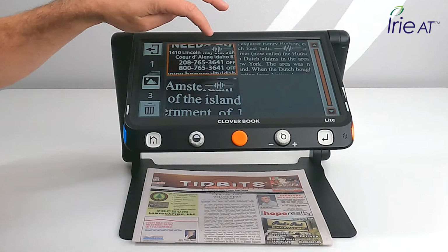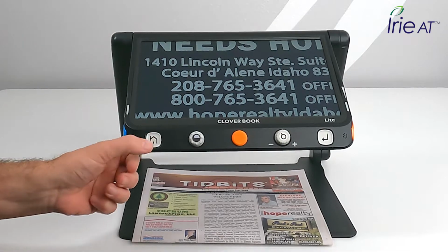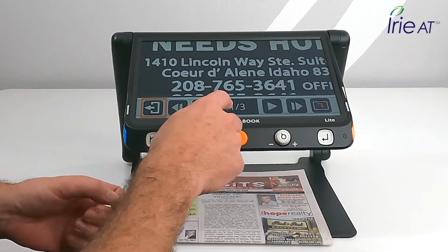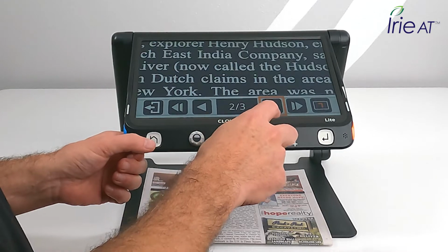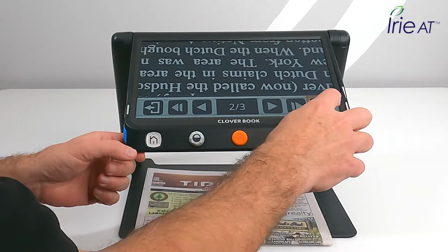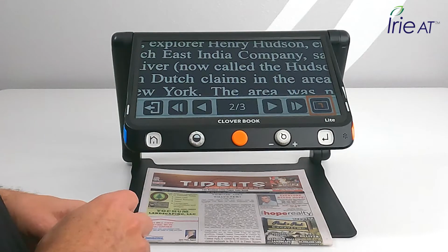Picture. Go into the pictures. And then this is the one that I just saved. I'll go back out of there so I can move around in this menu. I just quick pressed the home button. I can move back, I can move through the different pictures. I can change the rotation of them. Rotate. If I take a picture of something sideways. Rotate. Pretty cool little menu in there.